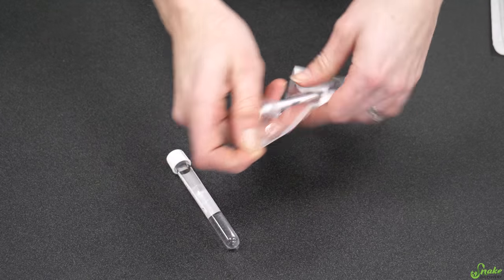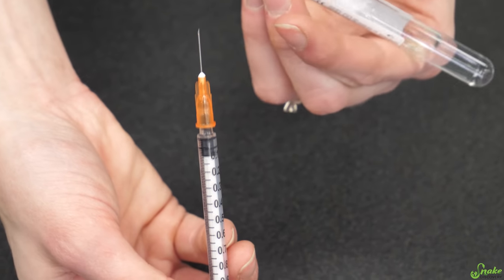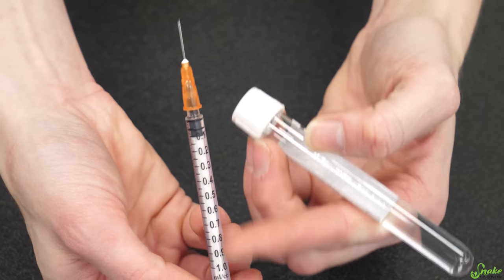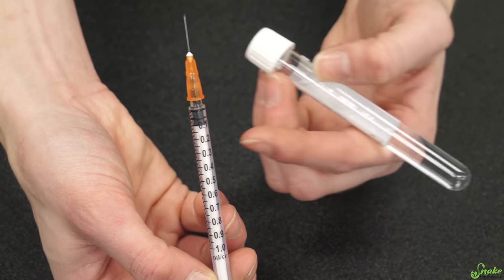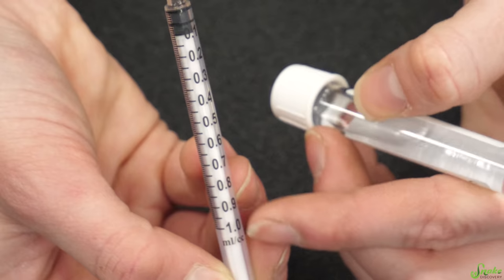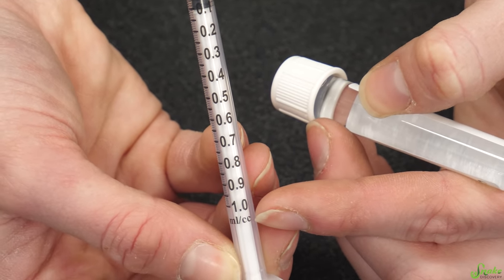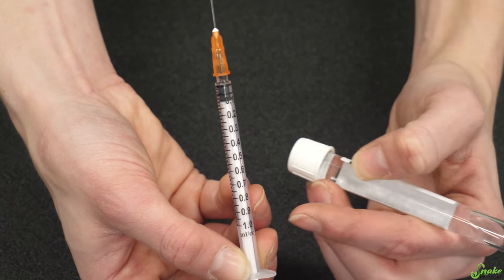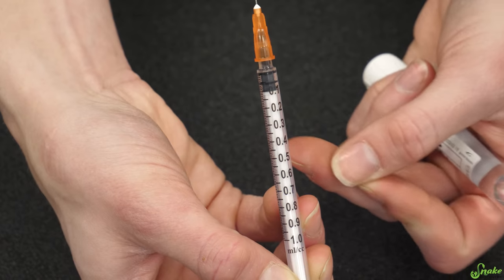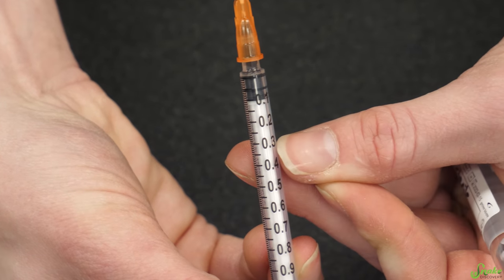The first thing you do is take out your needle, take off the cap, draw out your medication with needle-side up. Chances are you'll be given a one-mil syringe, because a lot of reptile medications don't require a whole lot for a single injection. Mils are the same thing as CC, or cubic centimeters, by the way. Now it's very important to read the prescription given by your vet and know exactly how much you need, because if you need 0.3 mils of a medication, you need to draw the plunger down to 0.3.